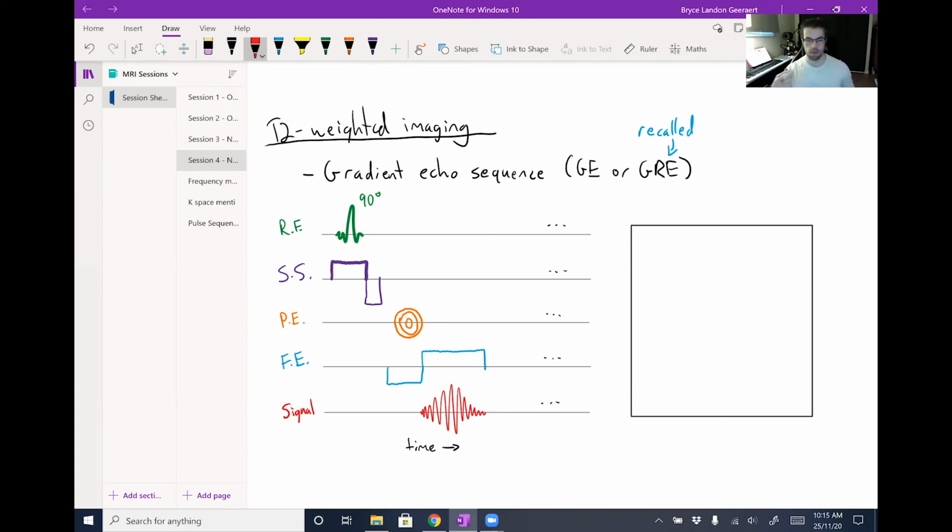phase difference. Sorry, we have balanced out our dephasing effects and then rephasing and then dephasing again in the echo, and that's just due to how we've laid out our gradients to account for the fact that when the frequency encoding gradient is on and we're reading out signal, we are also causing dephasing just because some spins are spinning faster than others.